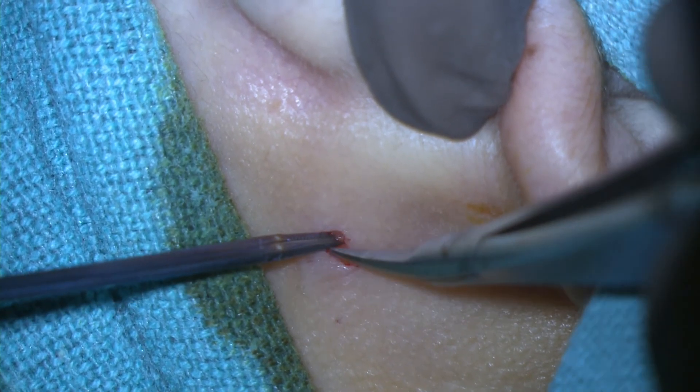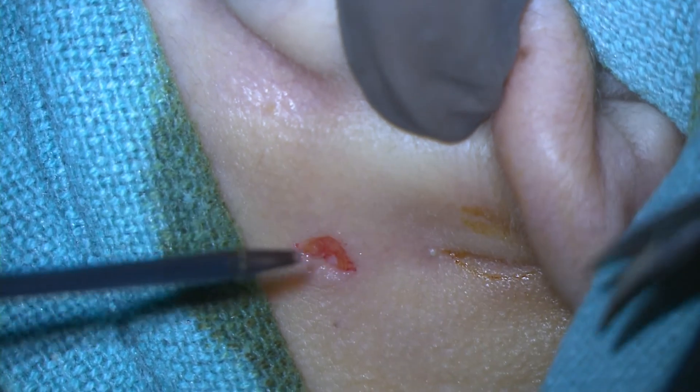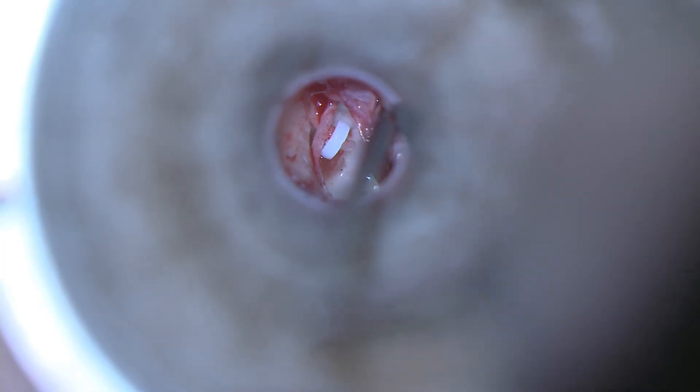Then harvest a soft tissue — a connective tissue or fat — which is important to plug the stapedius footplate area and the fenestra, to avoid any post-operative perilymph leak which could cause vertigo or sensorineural loss after stapedius surgery. Gently seal the fenestra, then remove the cotton ball, reposition the flap, and check for hearing intraoperatively.